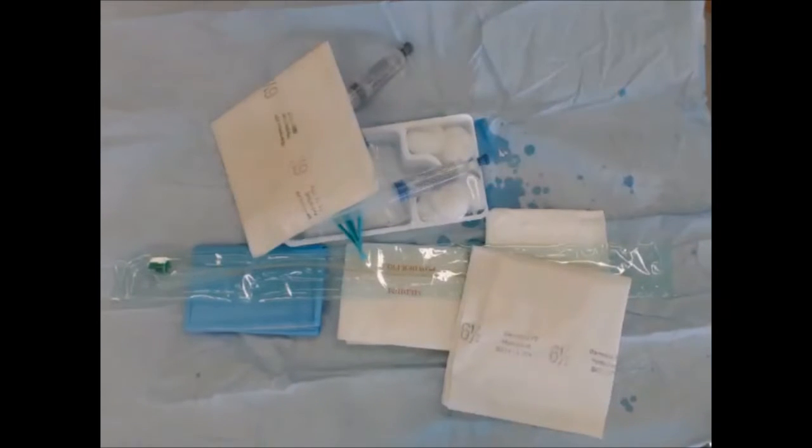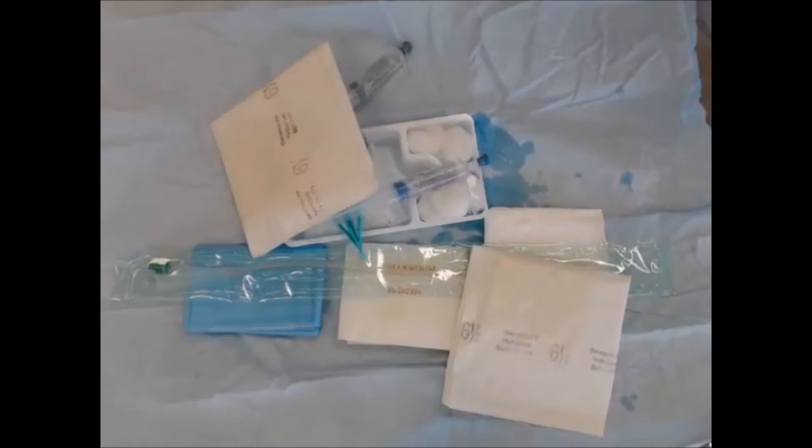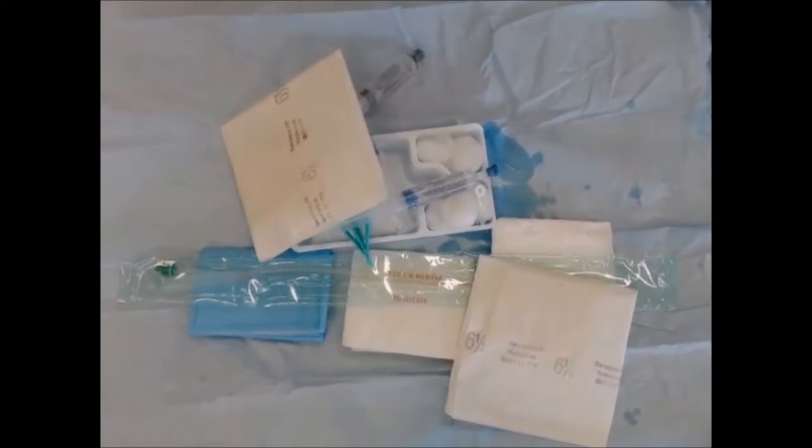Put your rubbish in the bag and check that you have everything in place. Choose the collection bag you want to use — for this patient we're using a regular urine collection bag. If the patient needed hourly urine monitoring, you would use an hourly collection bag. Open your sterile bag and place it somewhere close to the patient because you'll need to connect it up. It doesn't need to be on the sterile field, just place it close to the patient.